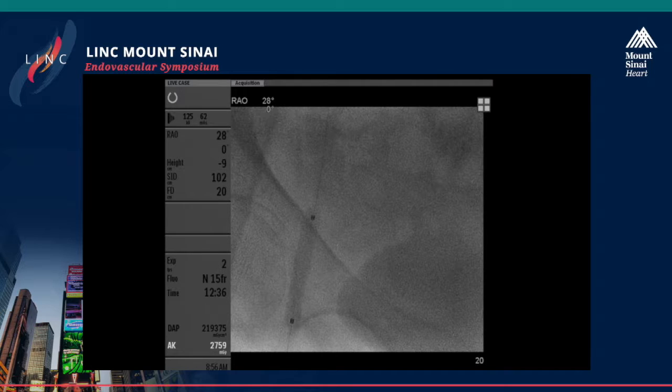So the one question I have for the panel is, in this kind of lesion where she denies having a procedure, although I agree with Dr. Anwar that clearly this does look like an injury from a catheter, is it appropriate to use a drug-coated balloon here? Because there's really not much atheroma, or what looks like a real atherosclerotic process going on in this common femoral. Well, I think there's enough of an atherosclerotic process that it does make sense. I think that would be a really good choice in this patient, drug-coated.